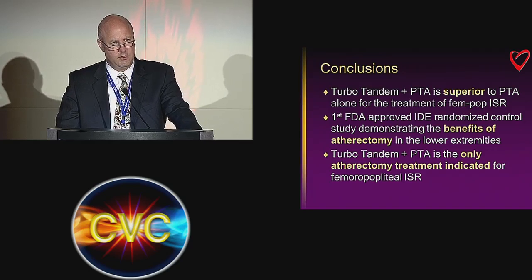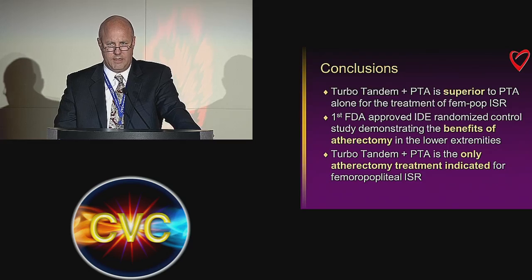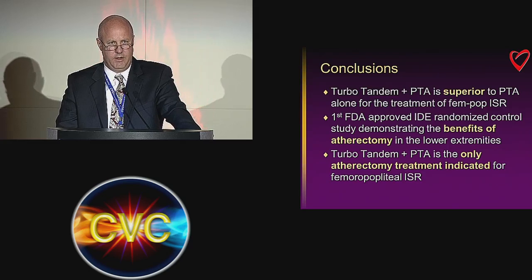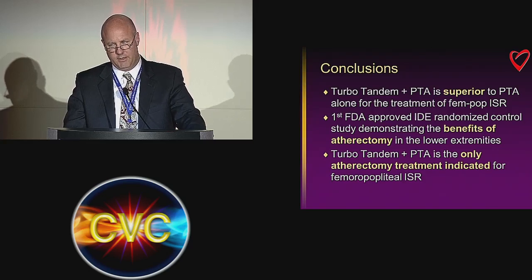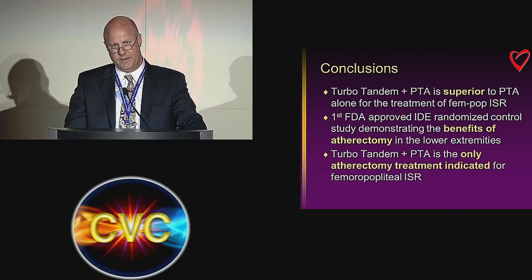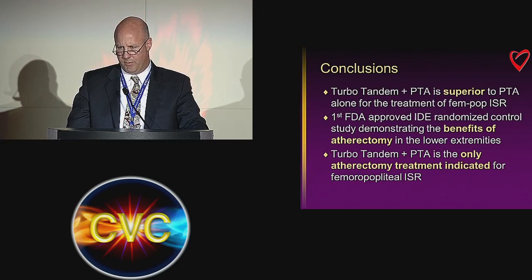There was a study that some of you may remember that started about 7 or 8 years ago called the Salvage Study. That was a study looking at laser debulking plus a Viabahn. For political reasons, that study was terminated after enrolling only about 28 patients. That has nothing to do with the medical outcomes. I think that combining these may be a very good alternative for long-term therapy.